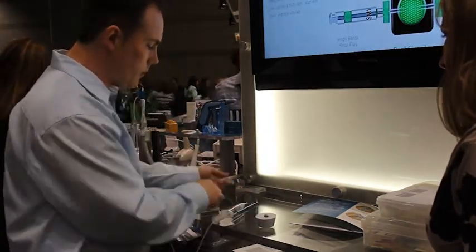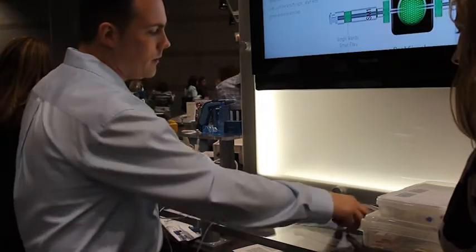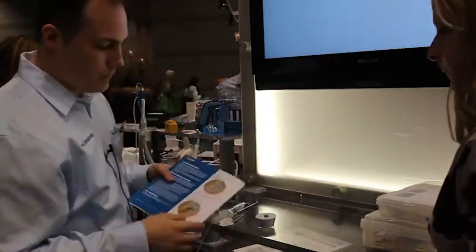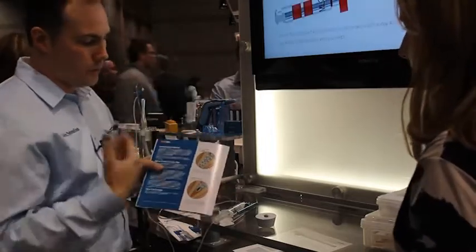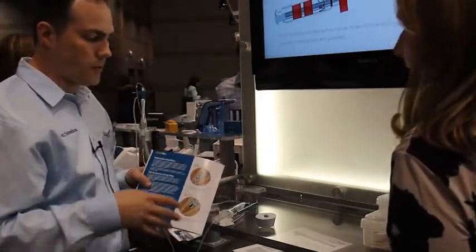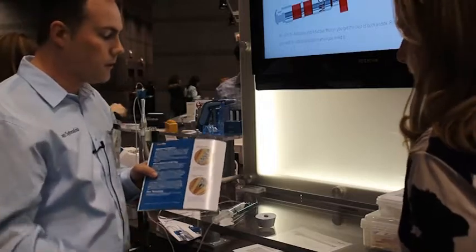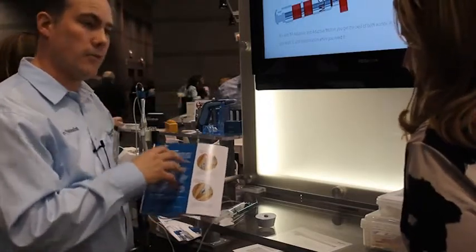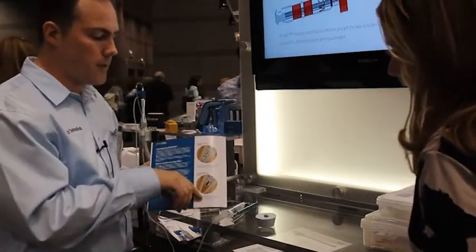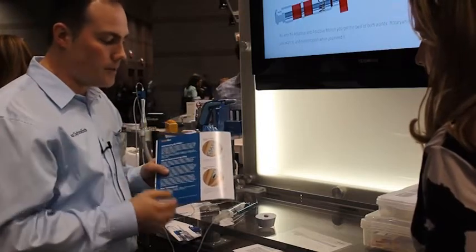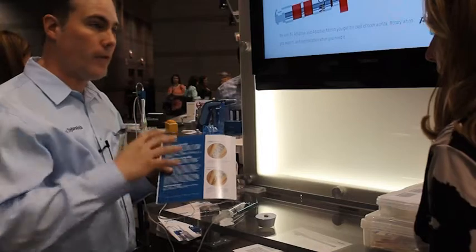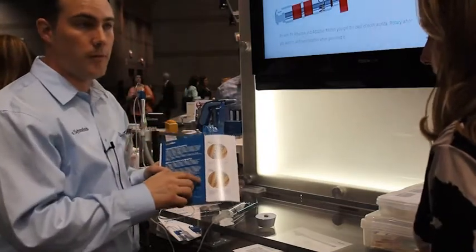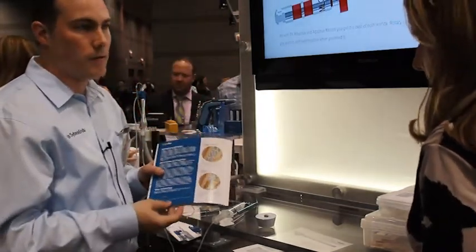So what you've accomplished in a very limited amount of time is you've, throughout your shaping process, had a nice fluid motion of that bleach and sodium hypochlorite to disinfect. You're able to move on to your macro cannula, get that larger debris out, and then essentially get all the way down to the working length of the canal and really pull out everything at that last one or two millimeters where a side vented needle is never going to get to.